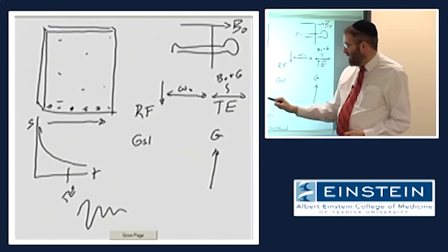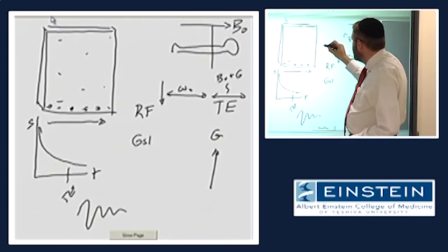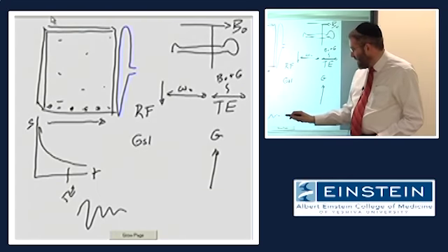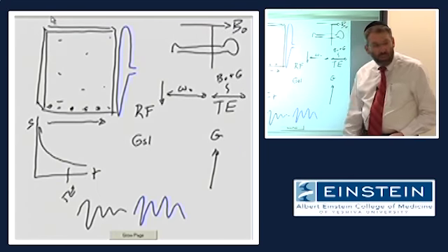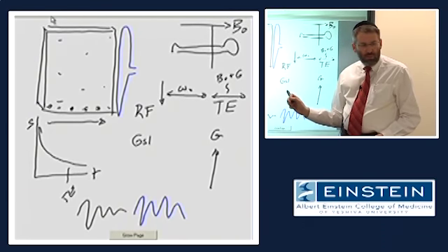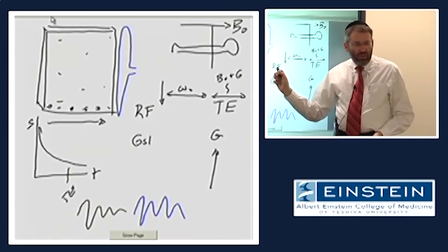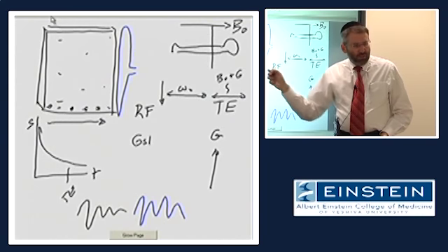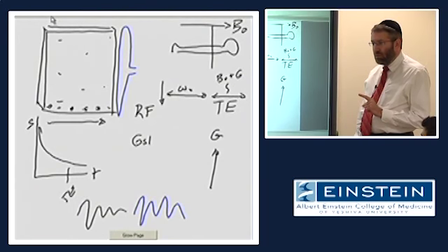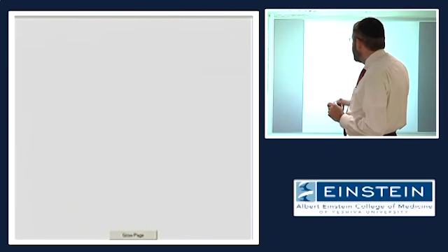Yet when we detect the signal with our single receiver coil, all we have is this one big coil here to sample it with. We detect this as one composite signal, which is essentially a sum of all of these components. So embedded in that signal is all of that information, which relates to the spatial distribution of signal along one more dimension in the image. Okay?